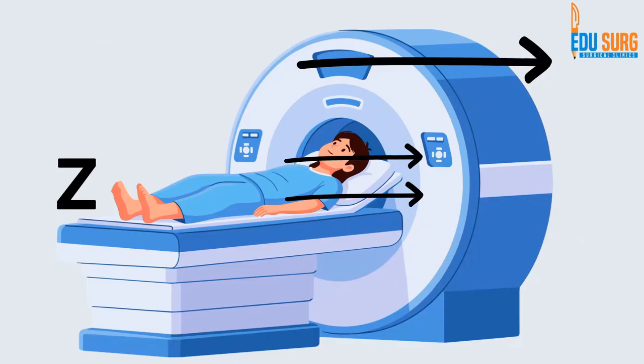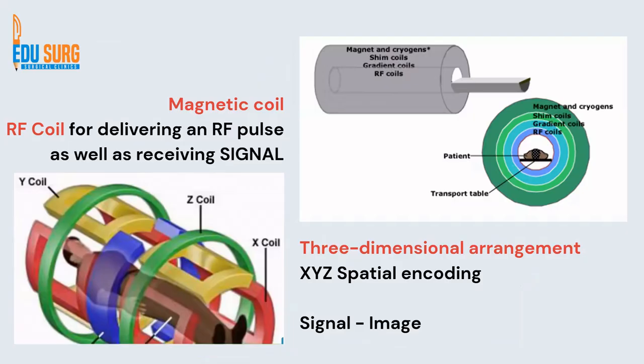This is one pulse. Okay, when you add another pulse, then one more pulse, there is a sequence of pulses that is happening. There is a gradient between the MRI, the magnet, and the RF coil, and this is what produces the image. Okay, so it is going back to the resting state of the protons that have been excited by the RF pulse, which produces the image.